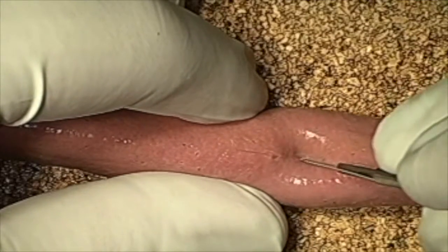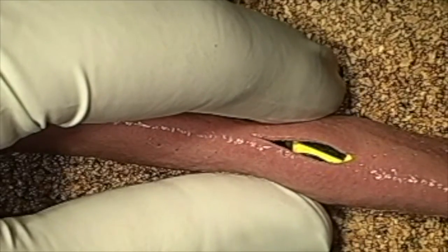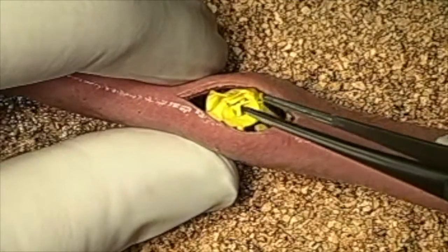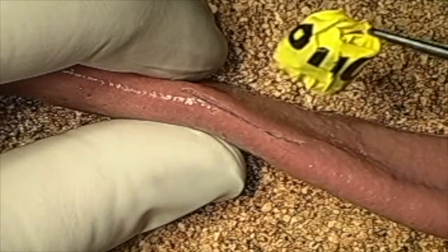Here's our 11 blade going in. This is a full thickness cut. It can also be done with a 15 blade as well. As you can see here, I'm trying to visualize that foreign body, which actually can't be completely removed. I'm actually using my Metzenbaum scissors to extend the incision a little bit. Once I have the foreign body externalized enough, I can use my forceps to actually remove it carefully. And obviously in surgery, we try to reduce contamination.